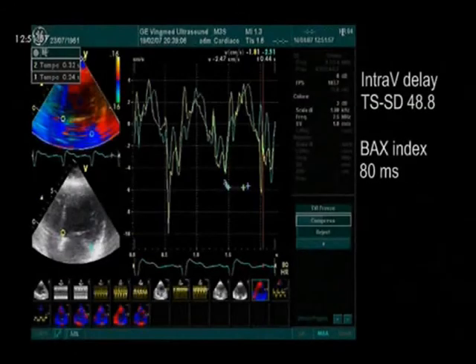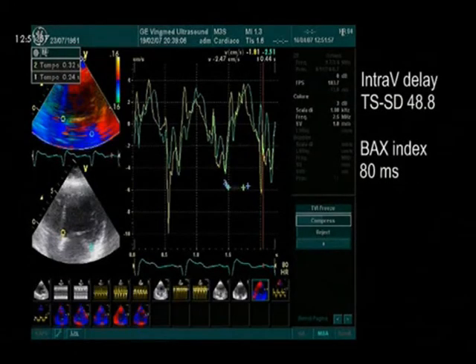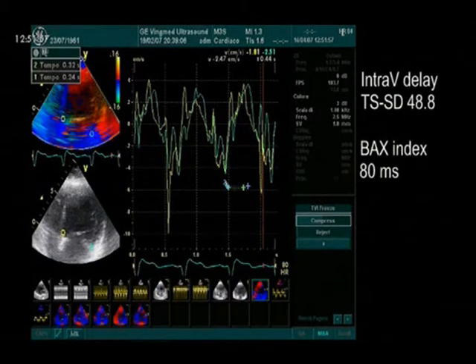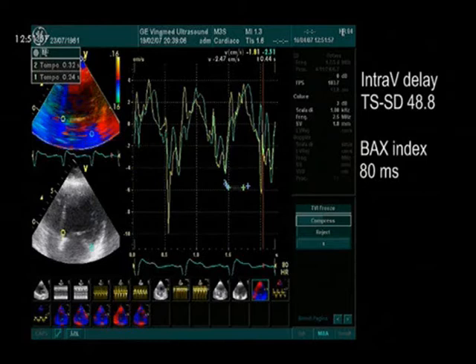The standard deviation of the time to peak systolic velocity is 48.8, and an index of 80 ms, indicating an overall marked systolic dyssynchrony.